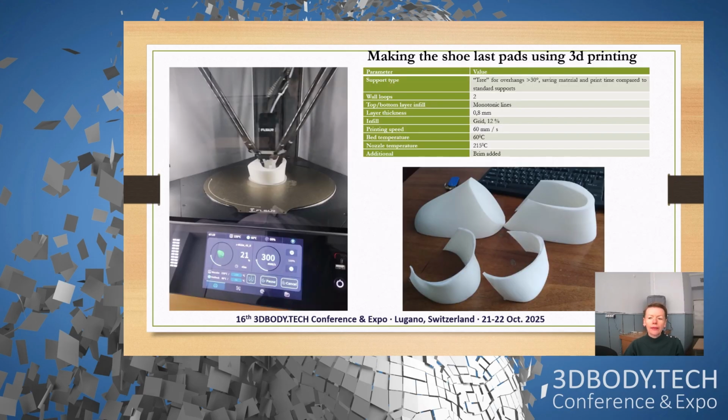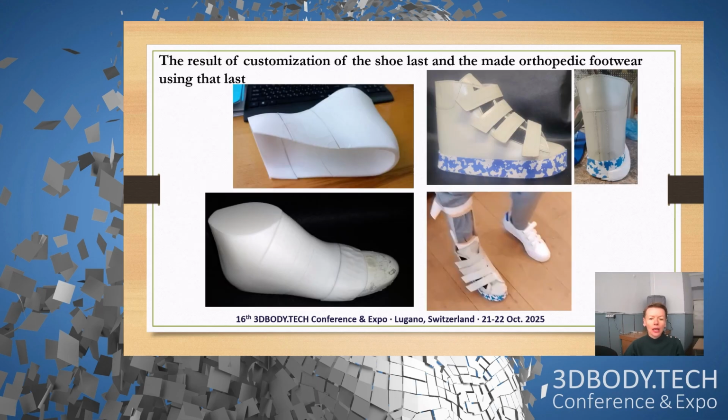We are making the shoe last pad using 3D printing. The result of customization of the shoe last and the made orthopedic footwear using that last you can see on this slide.